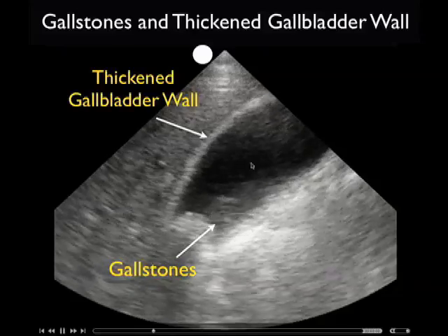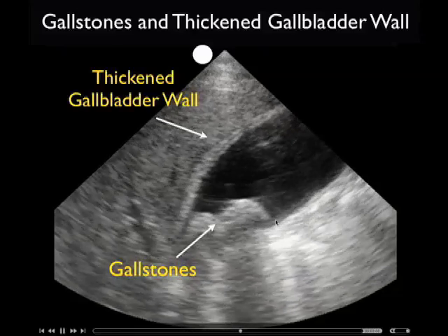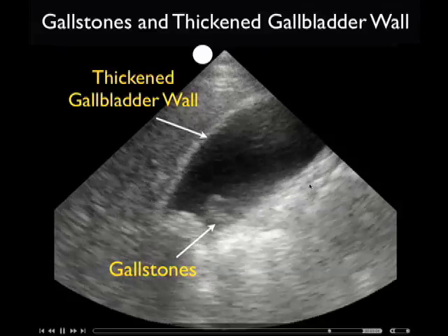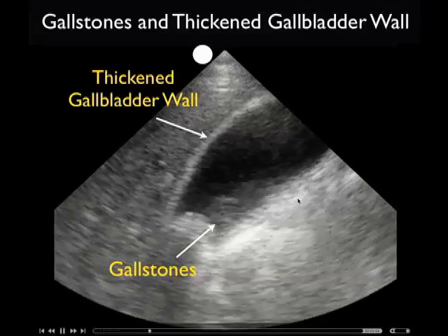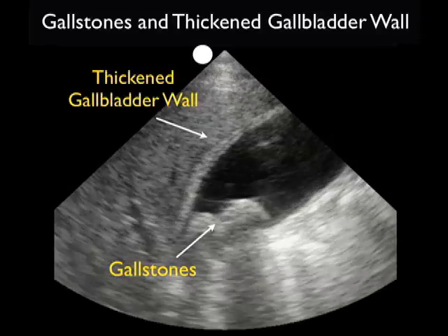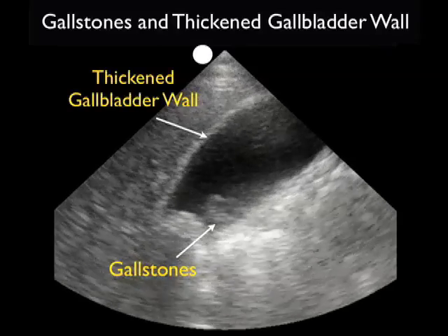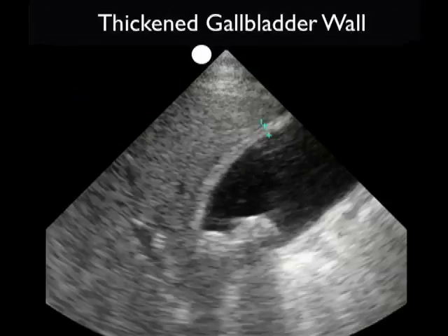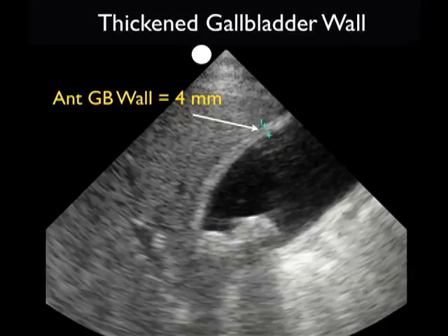Notice that it appears thickened. Here I'm just indicating the posterior wall of the gallbladder, and notice that it's difficult to measure the posterior wall due to an artifact known as posterior acoustic enhancement. The sound waves race through the gallbladder, making it difficult to measure that posterior wall as it lights up. Here we're going to put calipers down on the anterior gallbladder wall, and notice that we have a measurement of four millimeters, indicative of a thickened gallbladder wall as we defined prior — greater than three millimeters in width.